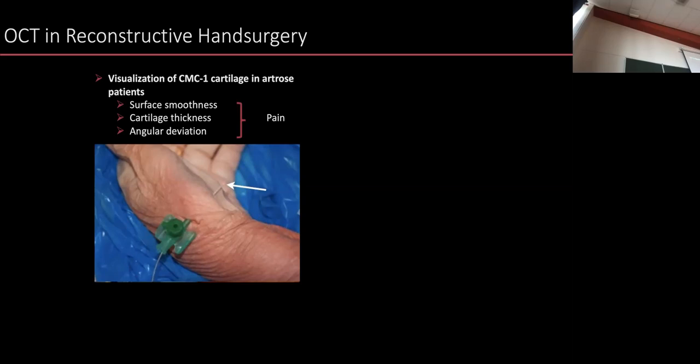And you know how they do this in humans? So this surgical table is beautiful. That arm is there, and they have this tool that grips the thumb, and then the plastic surgeon pulls on the arm, and you don't feel anything, and you create a gap of a centimeter there. It's possible. You have a gap, and when you have a gap, you can bring in a tool. That's where we come in.